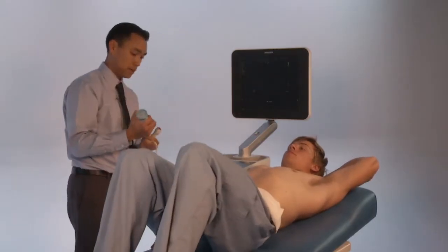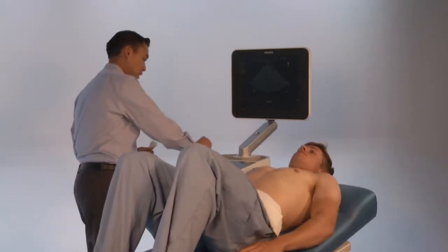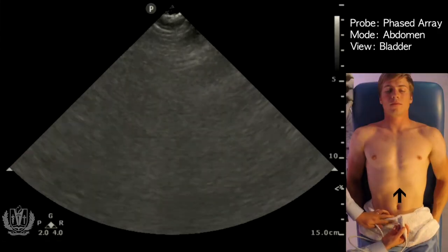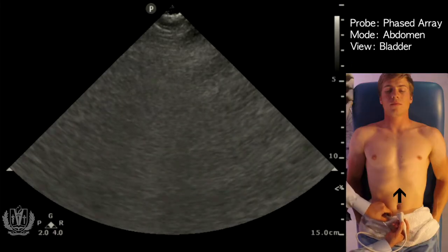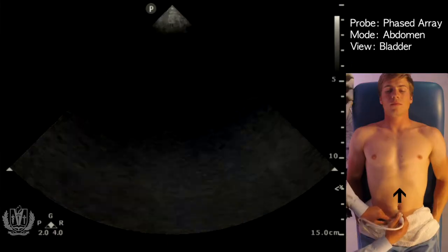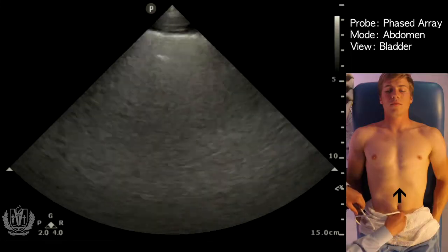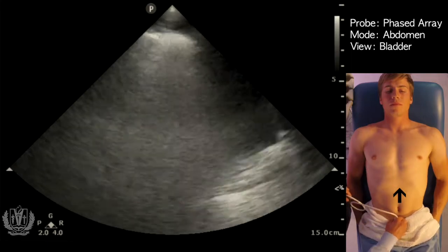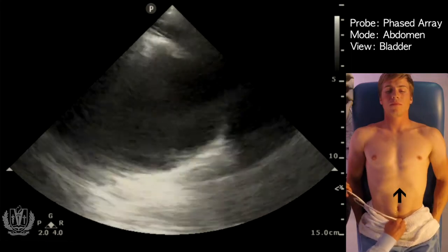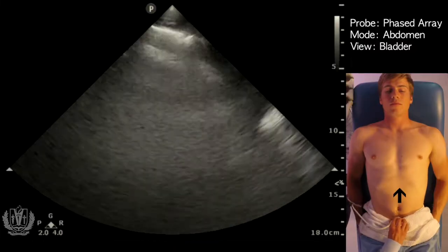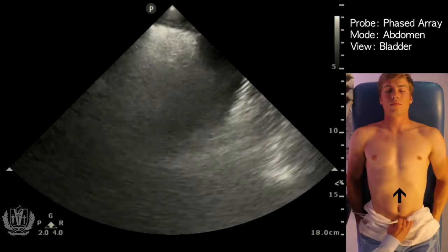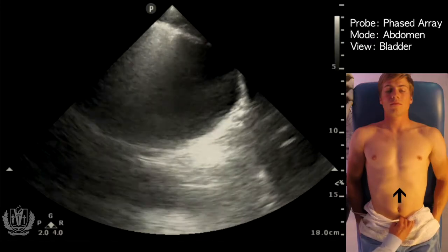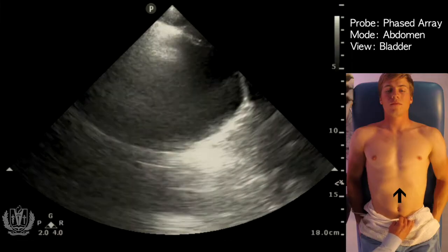The next scan we're going to perform is looking at the bladder, and you want to make sure you have a towel here to make the patient comfortable. The pitfall I see most often is that the sonographer does not direct the probe inferiorly enough to see the bladder. You want to make sure you're really close to the pubic bone to scan the bladder. The indicator is going to be up towards the head for a sagittal view, and here we see a filled bladder in the center of the screen.